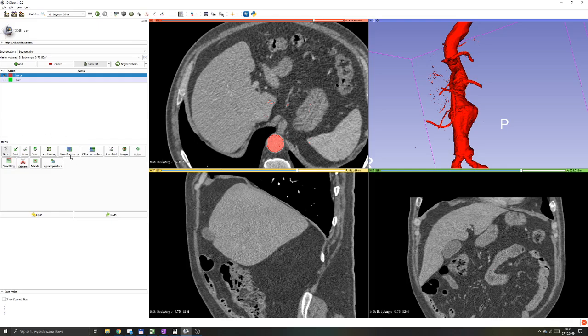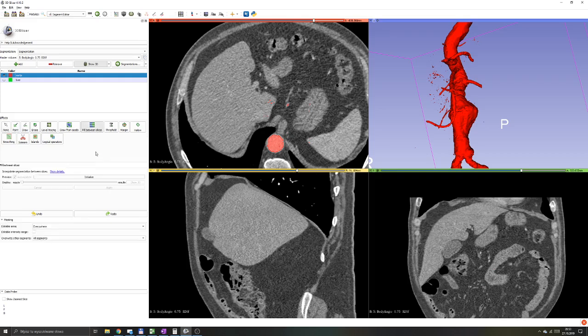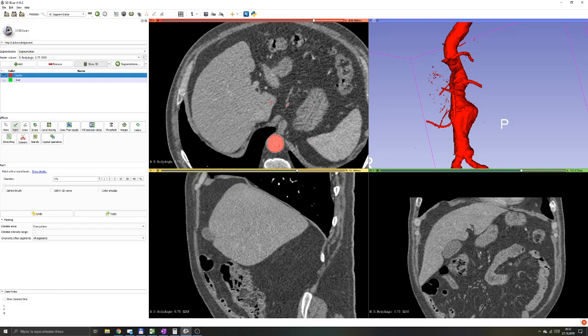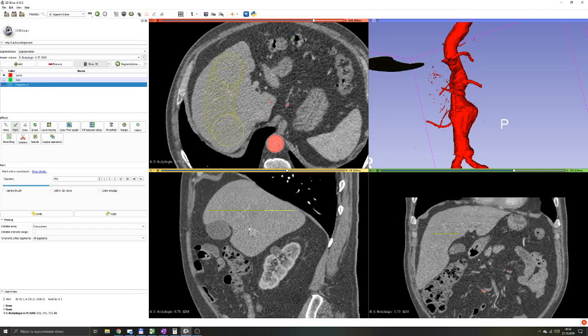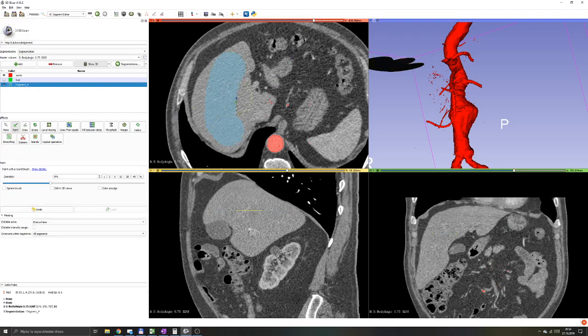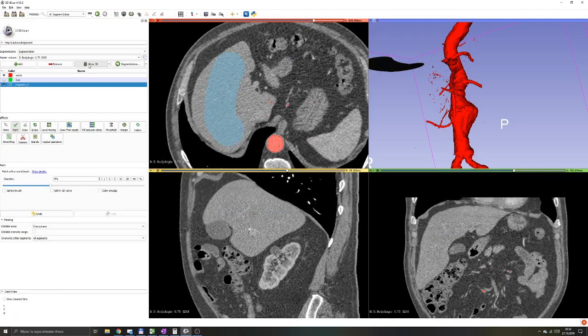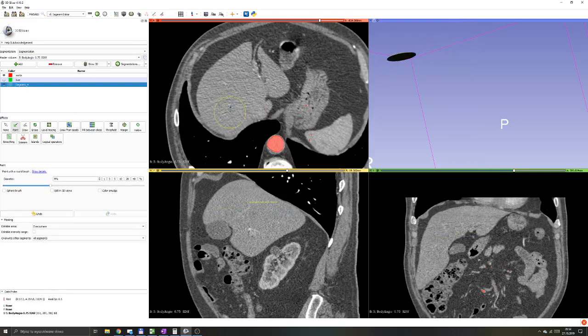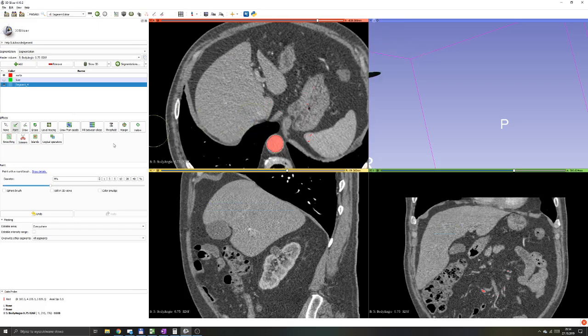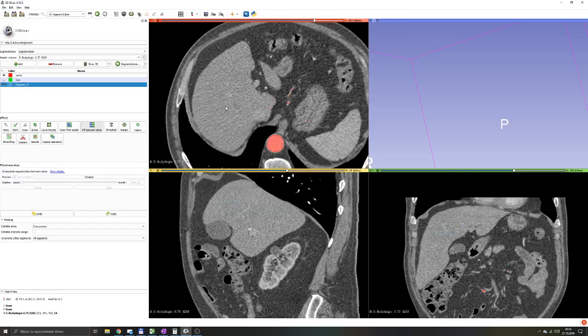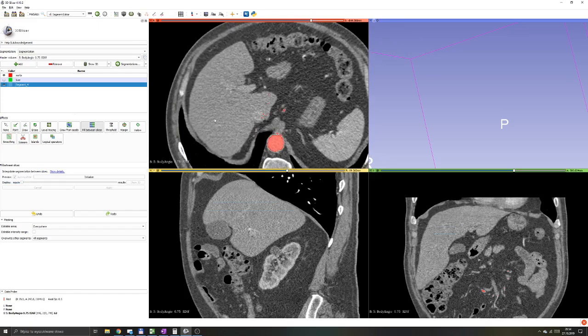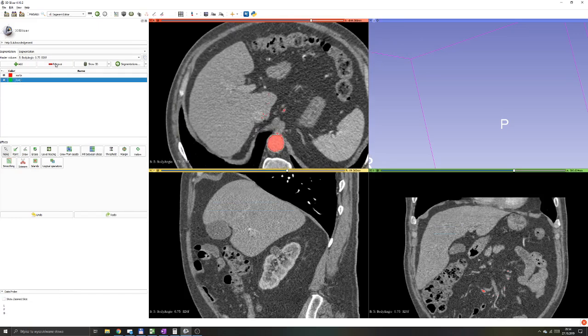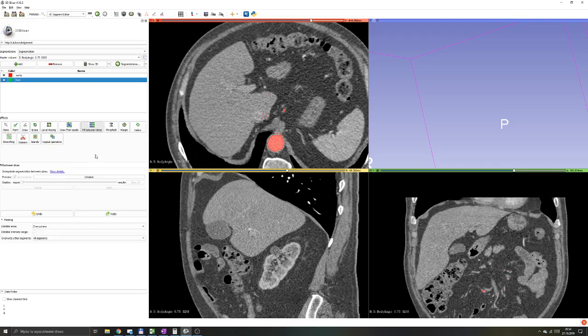Over here, you'll see that there are more methods such as fill between slices, and it basically interpolates segmentation between slices. That means if you draw your liver on one layer, then you go up a few, let's say 20 more layers, and you use fill between slices algorithm, it should interpolate. For me, this method didn't really work, and I really don't like this algorithm, so you might want to try it, but that is definitely not my favorite.